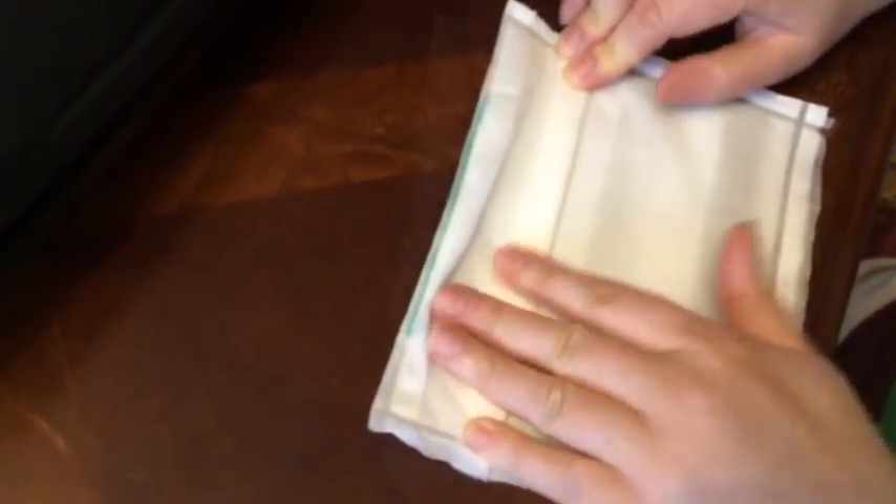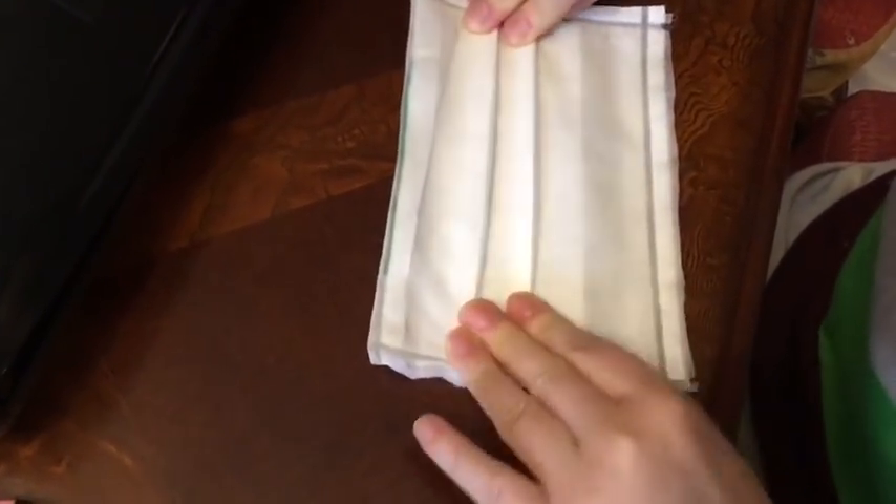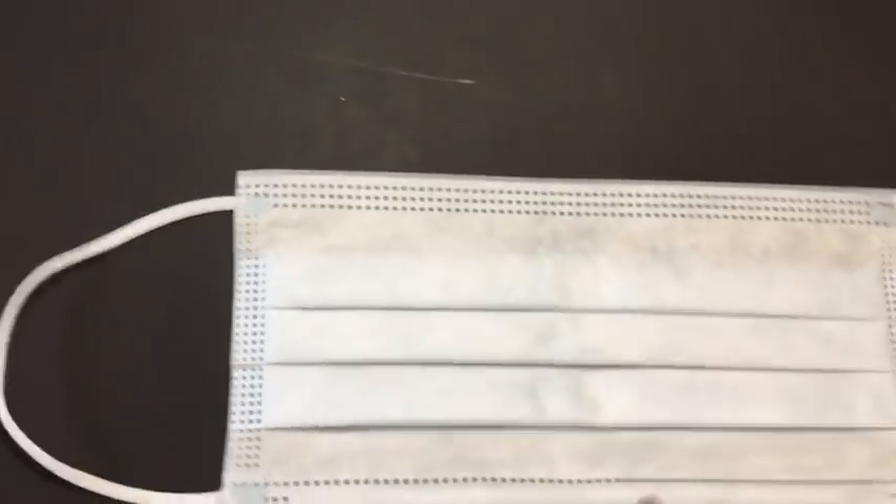You can see the grooves of the filter, and we're going to try to define these grooves. The grooves are also part of the reason why the filter works — they're another physical barrier, just like professional masks that are folded into grooves after assembly to make sure the filter works properly.